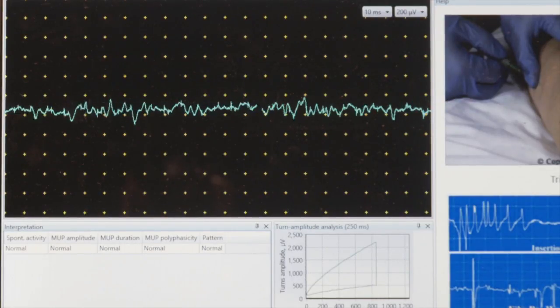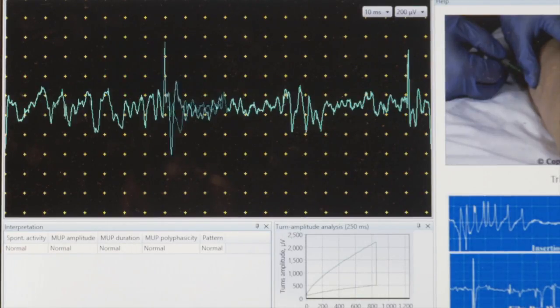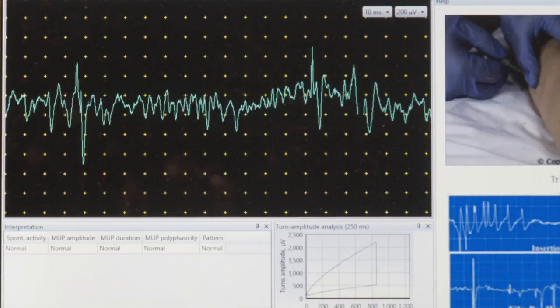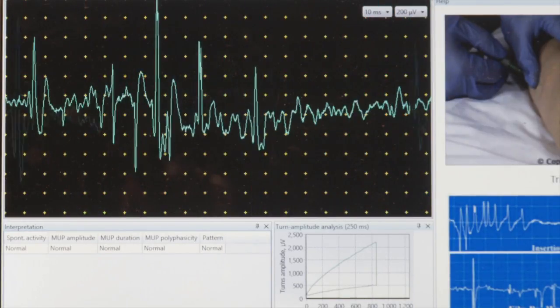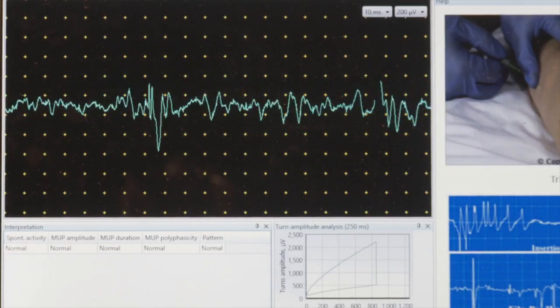Now to make sure I'm inside the muscle, I'm going to ask her to extend her forearm like so. I'm inside the muscle and that's a slight contraction.